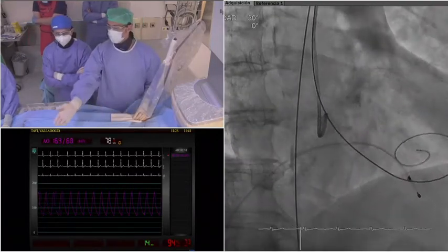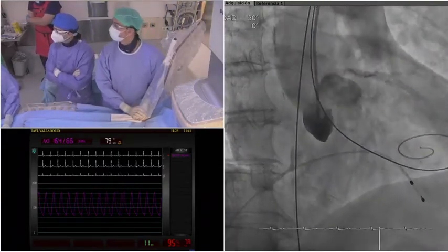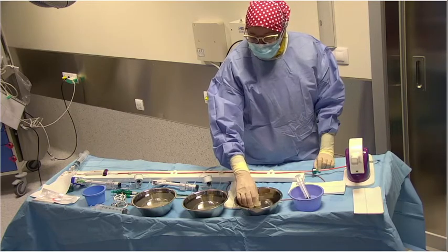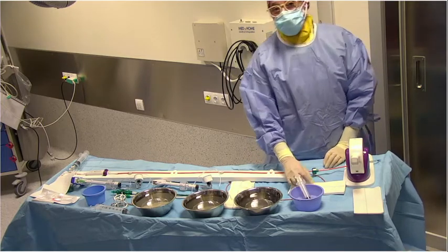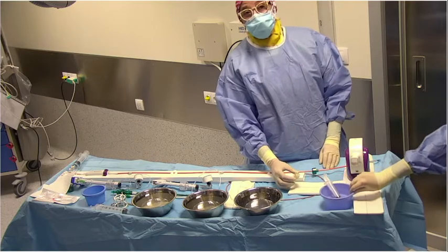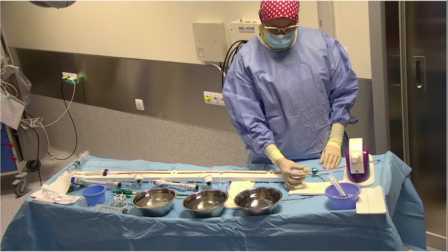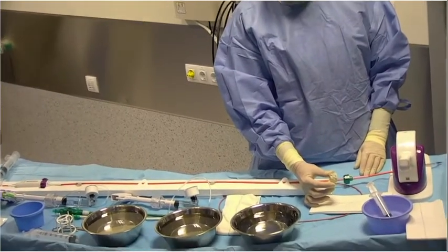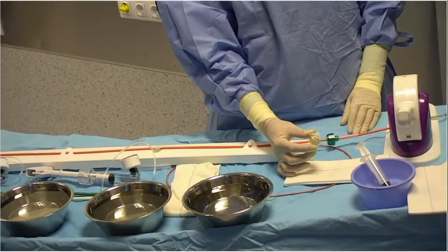So if you like, I can show you now the crimping of the valve. Can we see the table, please, there? So this is Belen, our nurse, who is crimping all our balloon expandable valves. She has already done the washing of the device. Can we see... Show the valve, Belen, to the camera, please. Hold it up high so it can be seen. There. We can see very well. Zoom, please. Yes, well, we can see the valve very well. Okay, and the crimper device and the navigator in place.